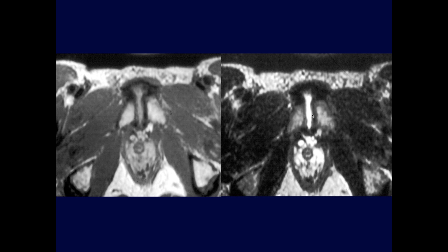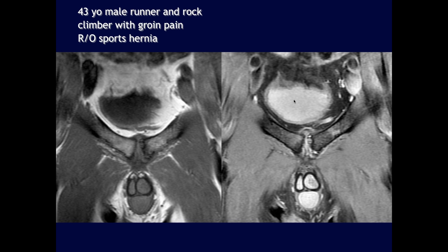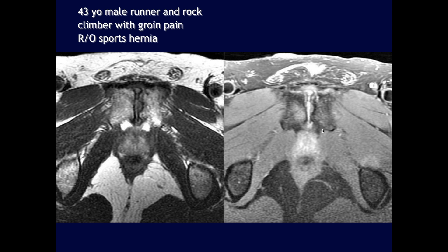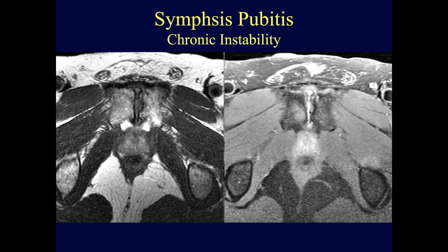Additional chronic examples show fluid within the symphysis pubis with marked thickening of the anterior capsule. A 43-year-old male runner and rock climber with groin pain shows hypertrophy of the symphysis pubis capsule, irregularity, increased signal in the left pubic ramus, and erosive changes — all compatible with symphysitis pubis and chronic instability after injury.